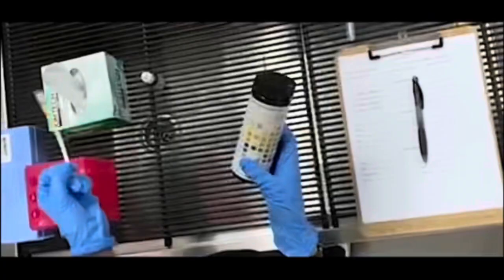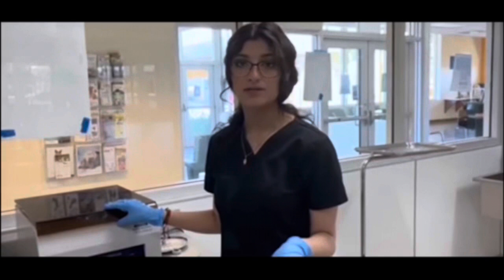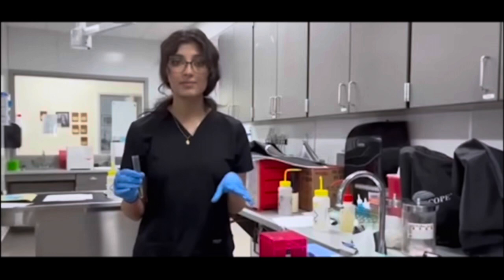Now that we have waited the six minutes, we're going to open up our centrifuge and take our sample back to the table. We're going to take our urine sample that we had spun in the centrifuge and dump it out — dump out what's going to come out — and keep the most concentrated part in the tube like that.